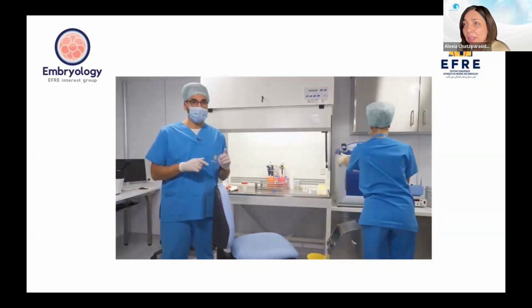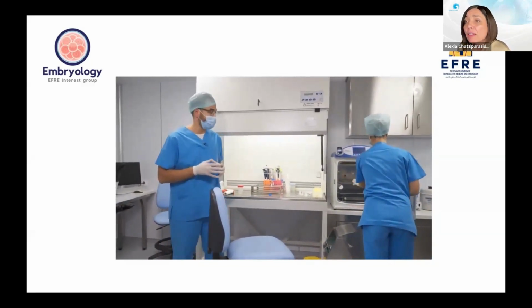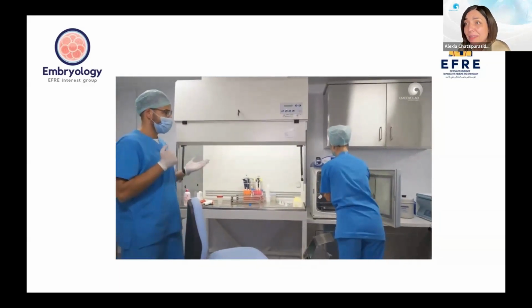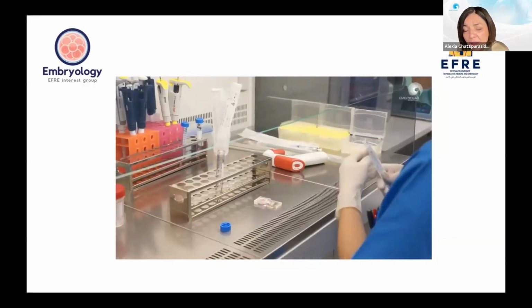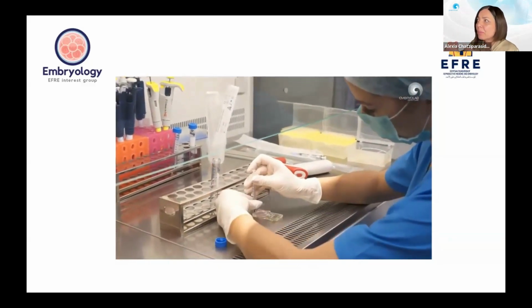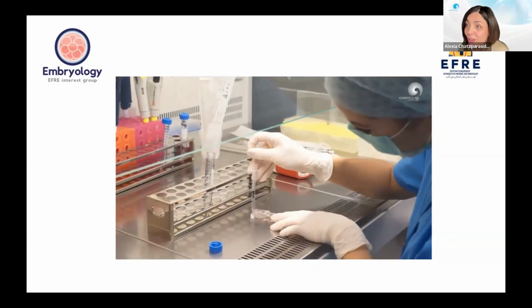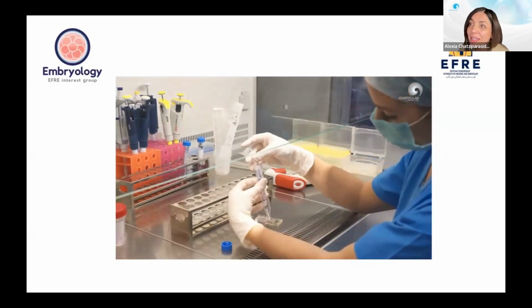And when we track the DNA fragmentation, what we saw is that even if we had recovery of DNA fragmentation, after a simple centrifugation step, the sperm structure deteriorates and goes back to a high level of DNA fragmentation, which means that these men still remain less tolerant to manipulations such as centrifugation, while the microfluidics seems to work well in selecting, with the ports they use, the technology, the spermatozoa with better structured DNA. The thing is that the samples that need us the most in terms of advanced selection, we don't have other tools other than centrifugation. So this is a limitation we currently have.